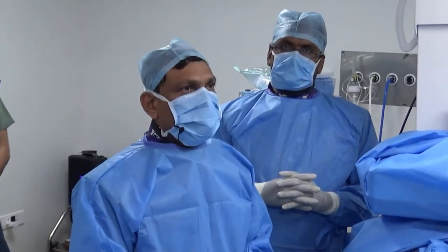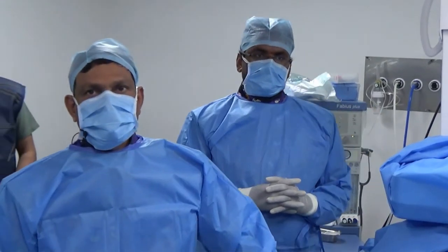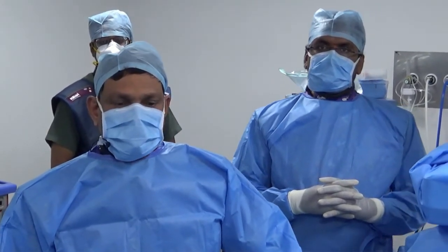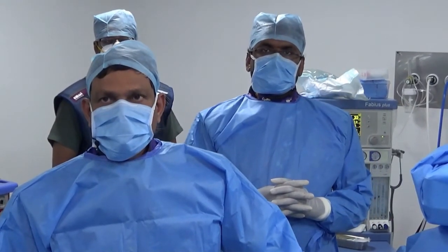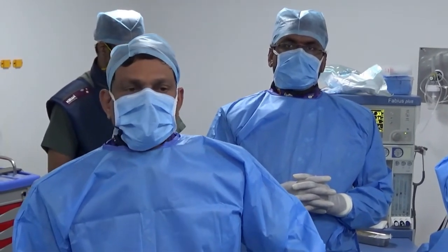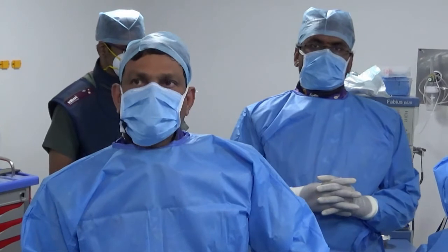I think it's not a bad thing at all in this situation to have residual flow, but it doesn't matter, I guess. Because you were going to use warfarin, that is why I was a little concerned with the use of warfarin and a residual flow. That's the reason. I take your point on that.